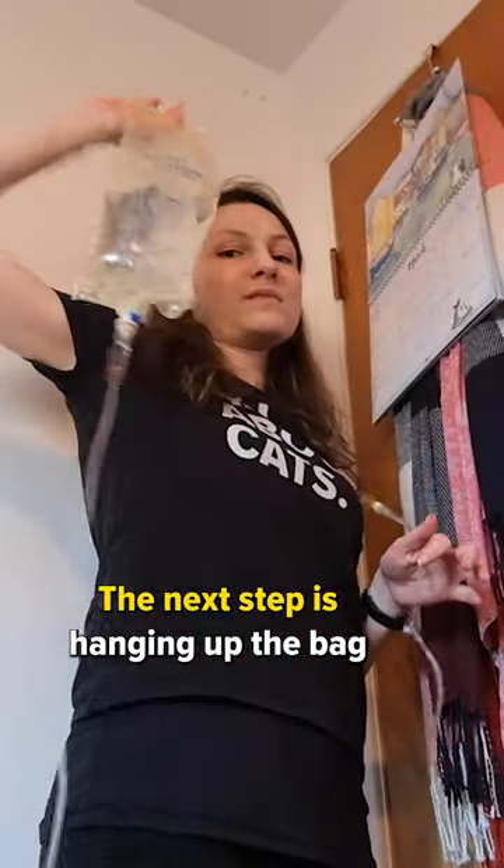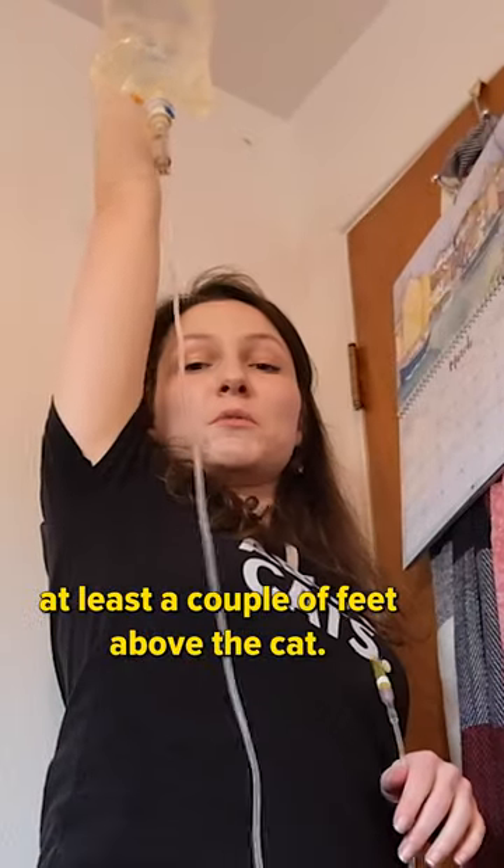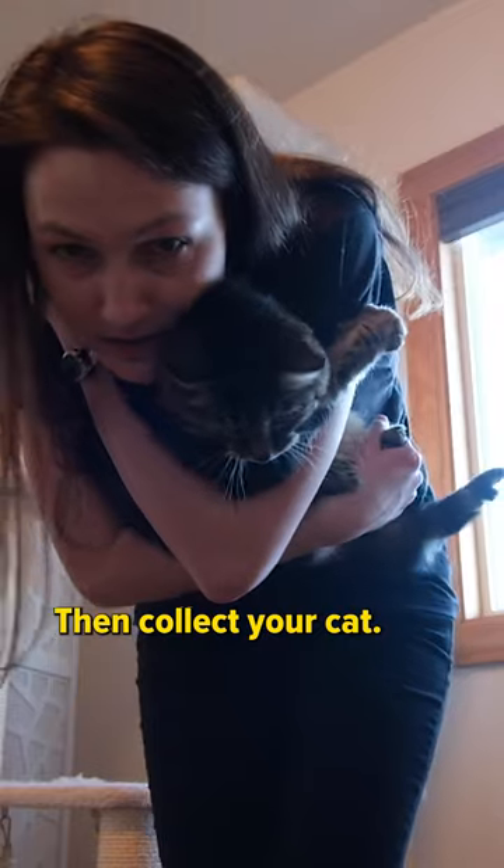My next step is hanging the bag at least a couple of feet above the cat. Then collect your cat.